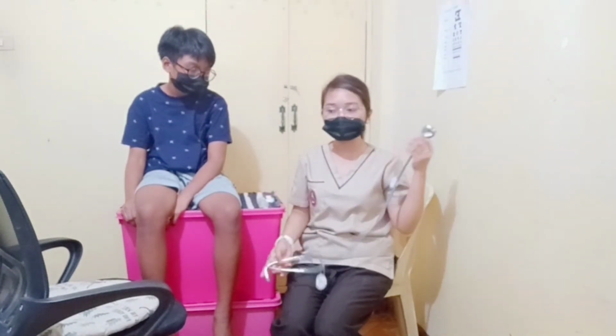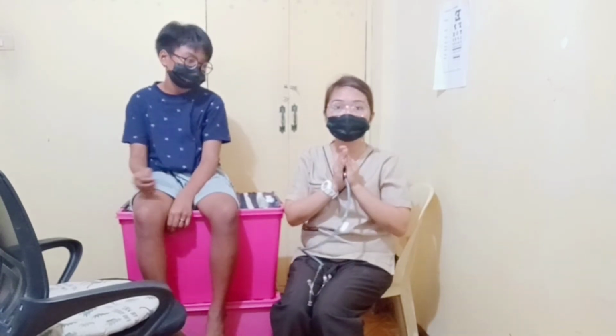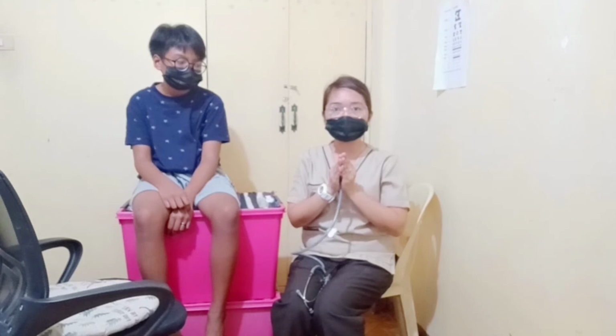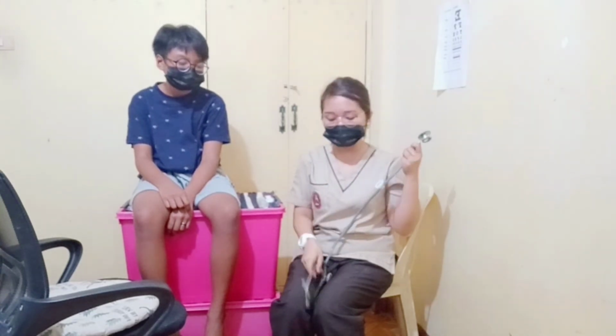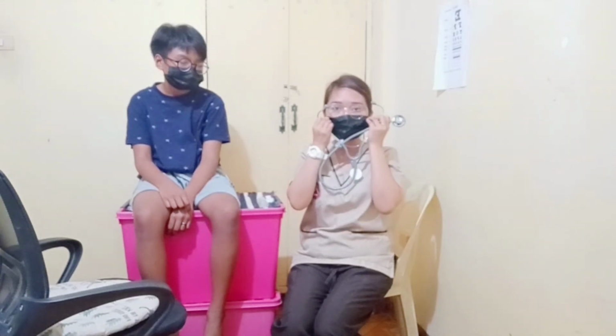So after we've cleaned the stethoscope, the next thing we have to do is warm the diaphragm a little bit using our palm. The reason for that is because if we don't warm it and just immediately put it on the chest of the patient, it may cause the patient to startle. So make sure that you first warm it, since our diaphragm is metal, so it's cold. After we have warmed the diaphragm, we have to make sure that we position the earpiece towards the ear canal for better hearing.